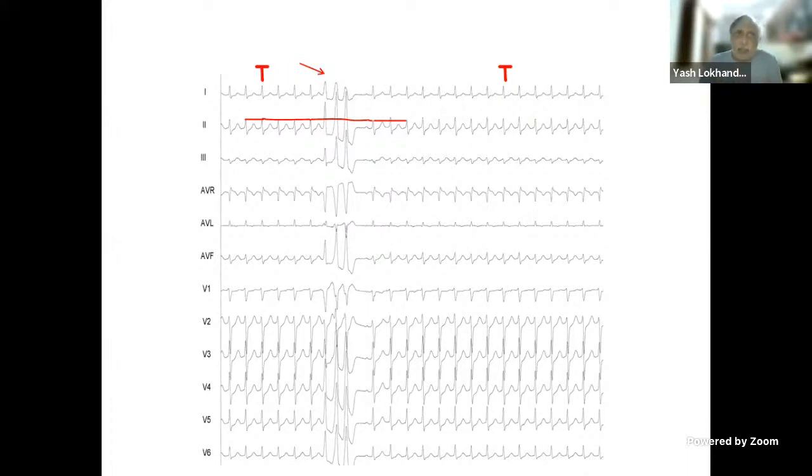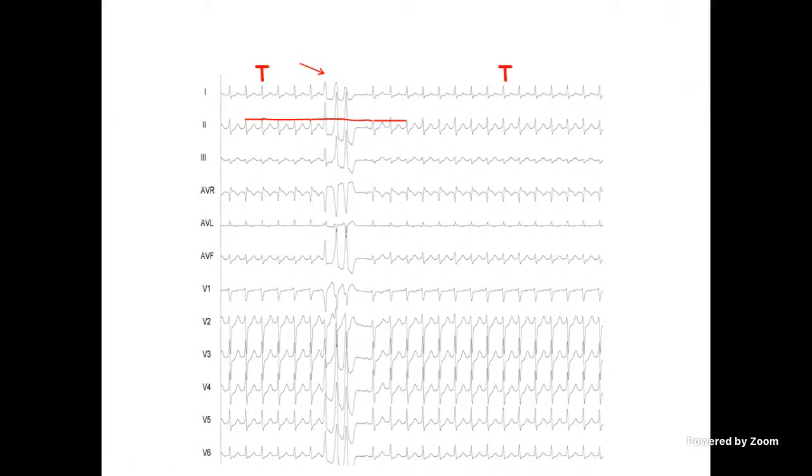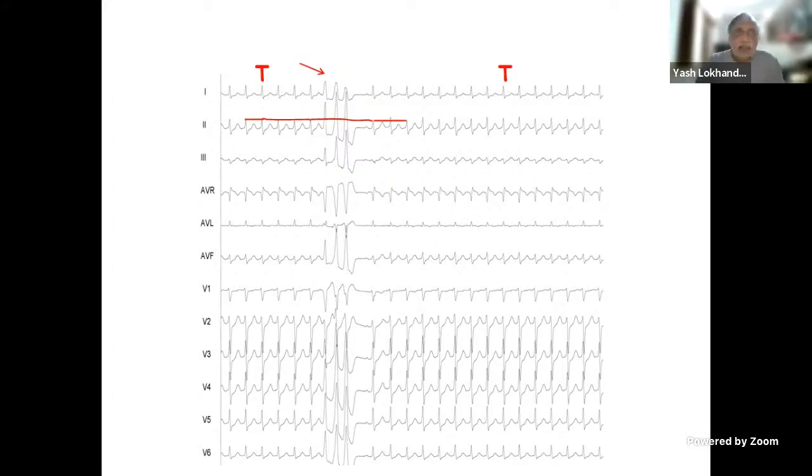If we take the second possibility, who said the second possibility, that tachycardia is terminated? Who said that? Yes, sir. So Umesh. Umesh, why don't you show yourself? This is not Saudi Arabia. You're not in a burqa. Okay. So, good. Umesh, now we take your possibility, that the tachycardia has terminated and it has restarted.